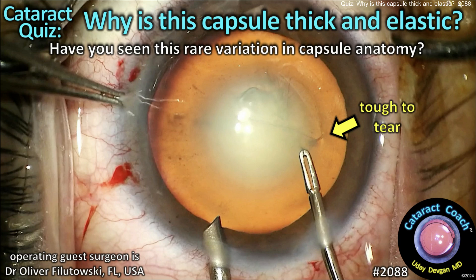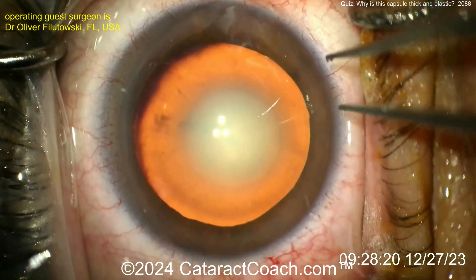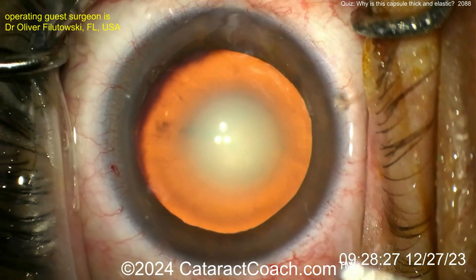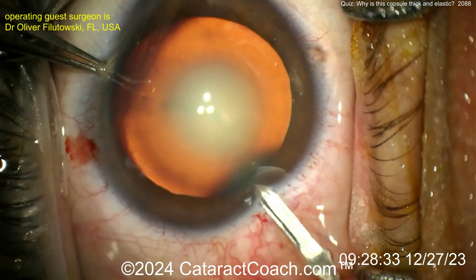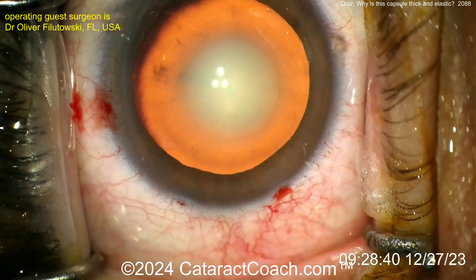CataractCoach.com cataract quiz: why is this capsule so thick and elastic? Have you seen this rare variation in capsule anatomy? This is a quiz where I need your help — I don't know what the answer is. A viewer sent in this video of a seemingly routine cataract surgery. You can see there's some central nucleus sclerosis, and this patient has about 20 out of 200 vision, with a few small pairs visible.